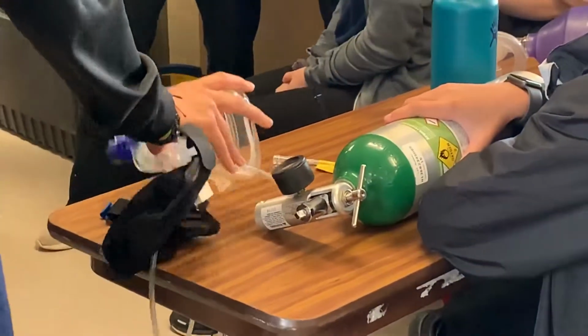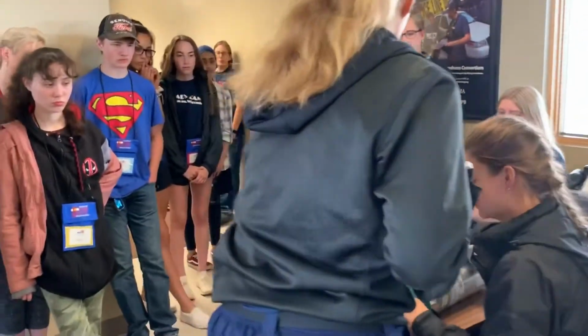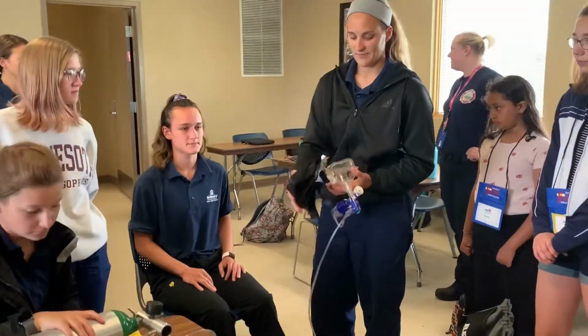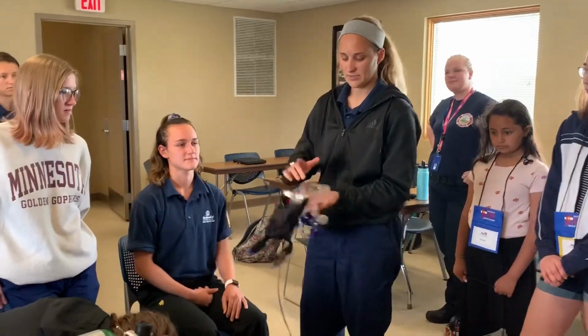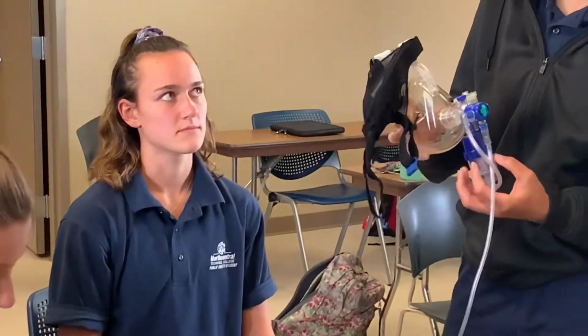This is what the C-PAP machine looks like. This attaches to the oxygen tank. This mask is what's applied. You'll have them sitting, obviously. This is the mask that's applied to their face. Don't worry, we'll clean it every time in between if you want to try it. This part goes on the bridge of their nose, and this is also a nebulizer.